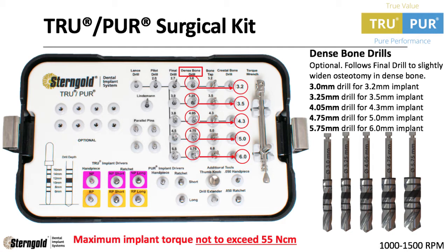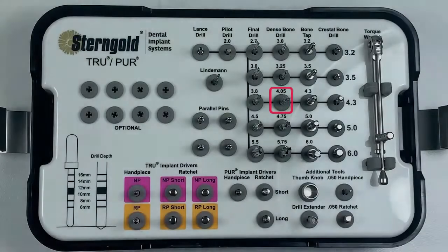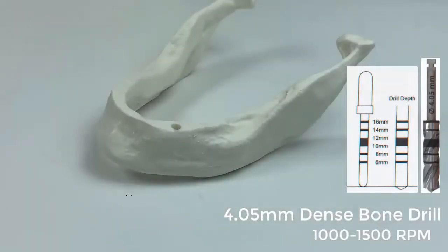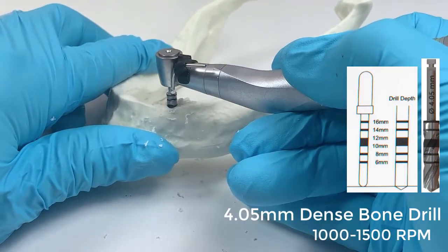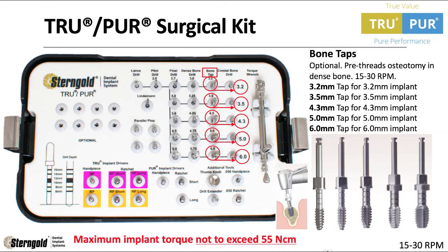Stern Gold has included the dense bone drills in the surgical kit, which follows the final drill to slightly widen the osteotomy in dense bone. We are placing a 4.3mm implant in this example, so let's use the 4.05mm dense bone drill. It is important to not exceed 55 newton centimeters of implant torque force when placing True or Pure dental implants.